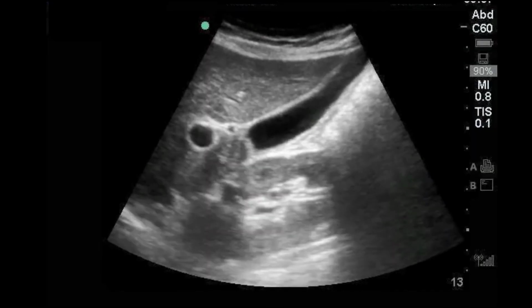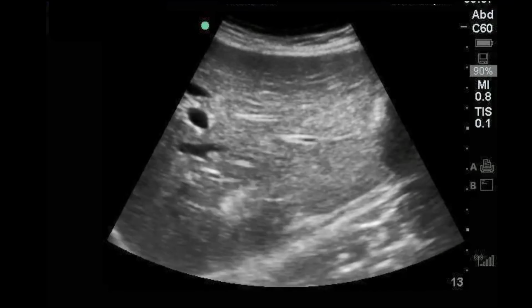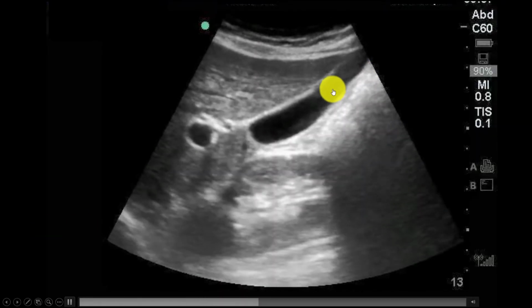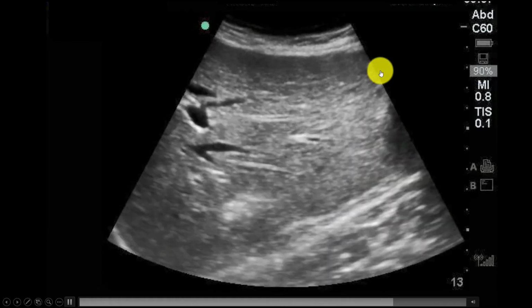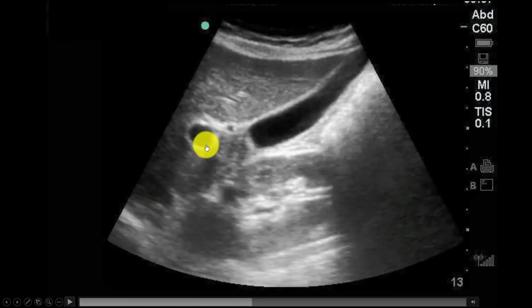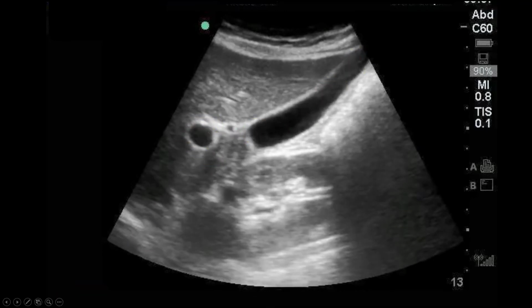Here's another gallbladder in the long axis view. Again, remember, gallbladders come in all different shapes and sizes. So this is a relatively skinny gallbladder with some folds in it as well. But you see again, the gallbladder lumen itself points towards the portal vein, which you identify here. So this is a little bit of a more curvy exclamation point.